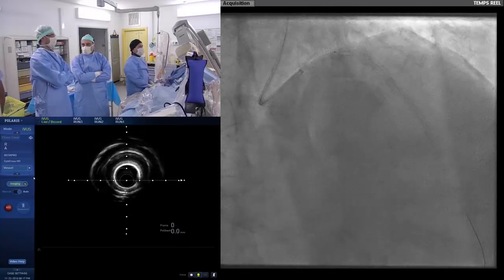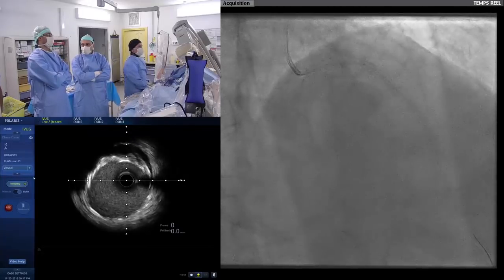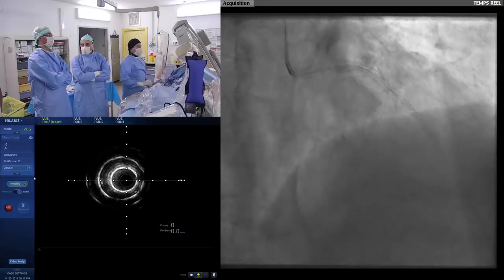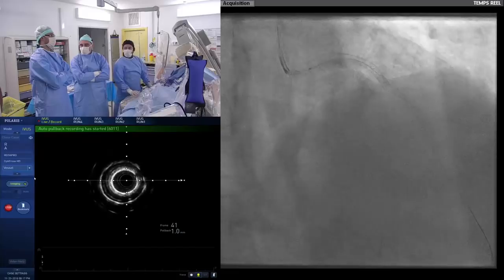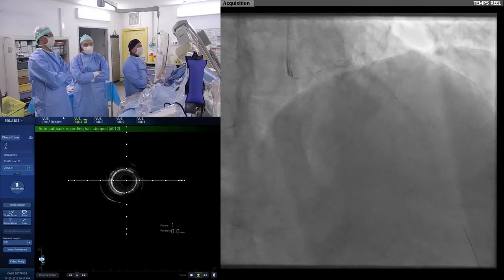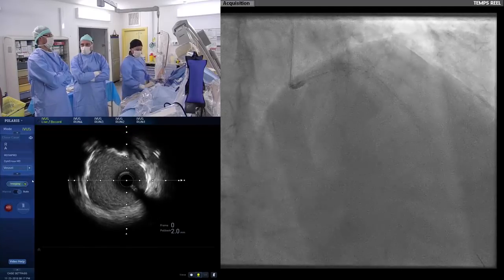So I am... Yes, there you are. Okay, so, you didn't inject systematically nitrate after stenting before IVUS again? No. So we do, sorry. My probe is not in the good place. So at this. Yeah. There you go again.